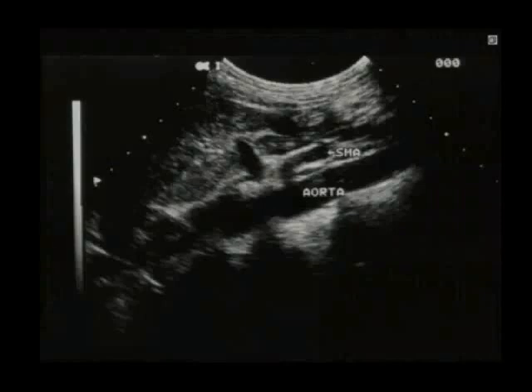Here's a sagittal view of the aorta, and we actually have the SMA marked off there, so you can see branches relatively easily. How do you know that's the SMA? Is it just from your location on the body? Right, this is high in the abdomen, superior in the aorta, and then you're going to have the celiac axis there.